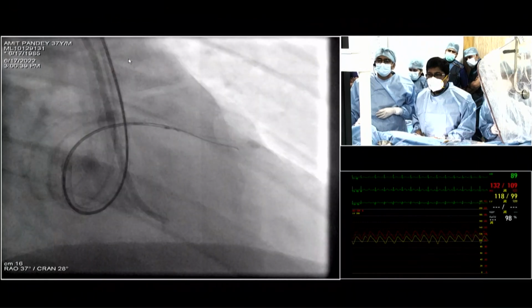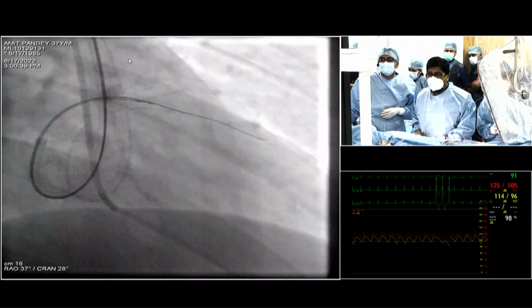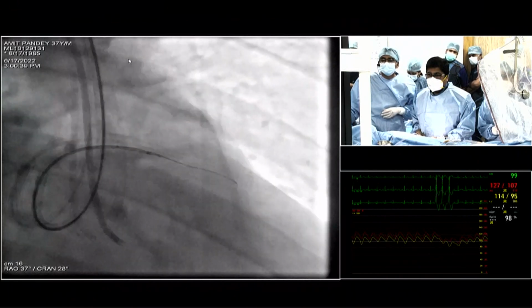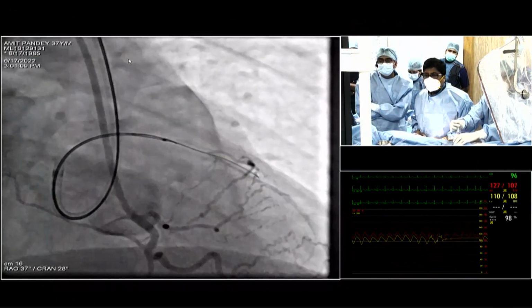That's a Conquest Pro, Dr. Goel? Okay. Yes. He's there somewhere. Check PVCs. Check. You have a run. Just be careful.